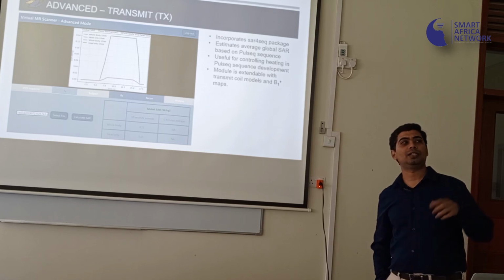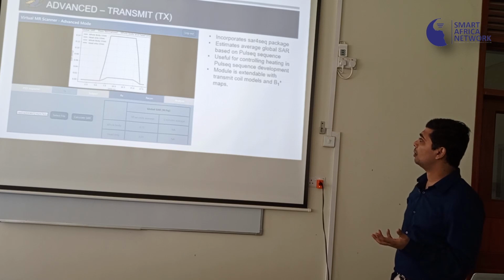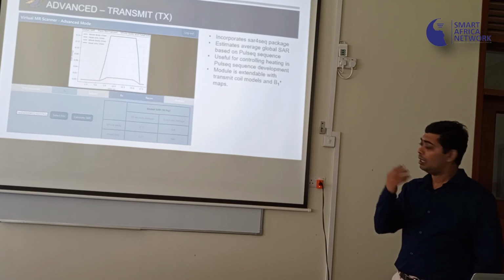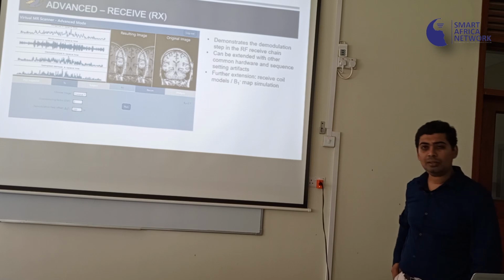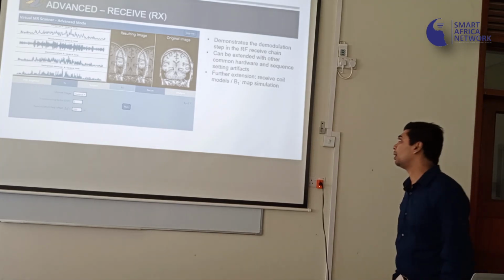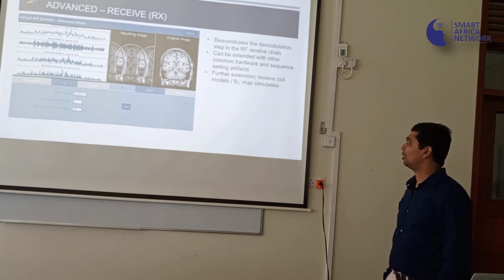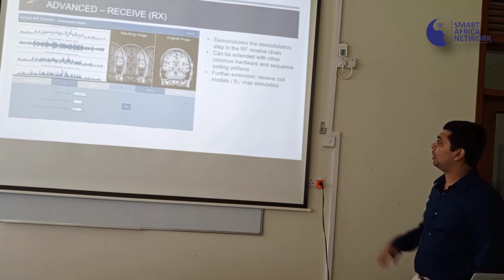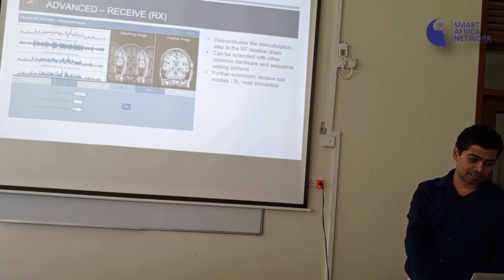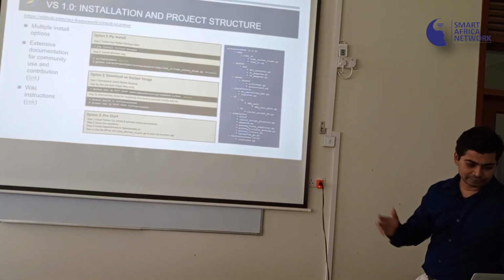If you want to get into the research mode and say I want to look at designing RF transmit and look at the SAR profiles and things like that, you could do that too. You could also look at advanced reconstructions using deep learning, where we've shown an example where you can undergo aliasing because of undersampling in k-space and be able to reconstruct original images as well. So all of this again is on the browser. Once you install it, you can get going.